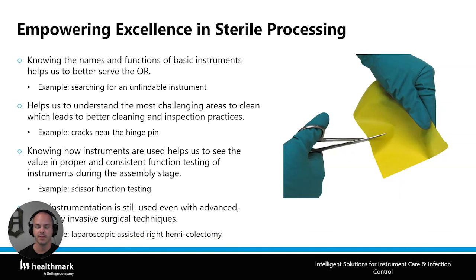The other thing is even though surgery is taking on more advanced techniques and it's becoming more minimally invasive, what's important to know is that even in those procedures, oftentimes we're still using basic instrumentation. So, say, for example, a bowel resection, sometimes they're going to do a laparoscopic assisted right hemicolectomy.